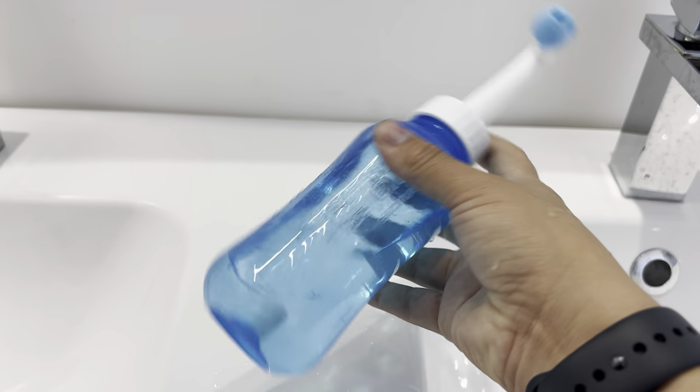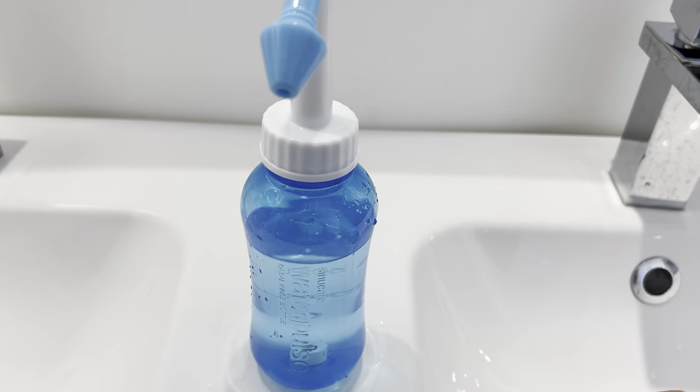Shake it a little bit and let's try it. The salt dissolves quite fast. Now it's time to use it — I just have to flip it this way.